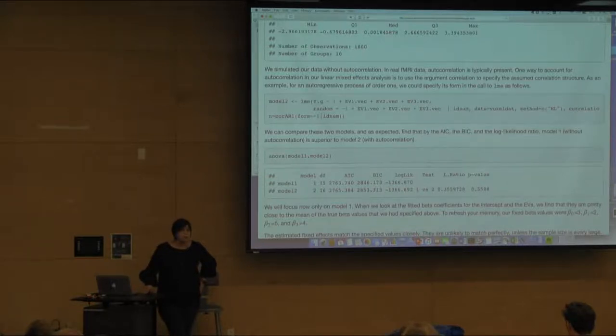Yeah. I think FSL computes the autocorrelation on the raw data and then applies it to the regressor, say? I think it uses a pre-whitening technique, right? So it's basically modifying the design matrix to account for the autocorrelation that it observes, right? I know what FSL does. I don't know. I asked a question, I threw it out there, but I don't actually know what the other packages do. SPM does take care of it too. But you just don't know how specifically?